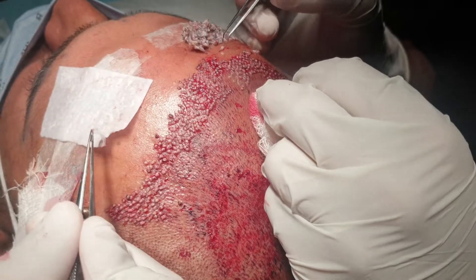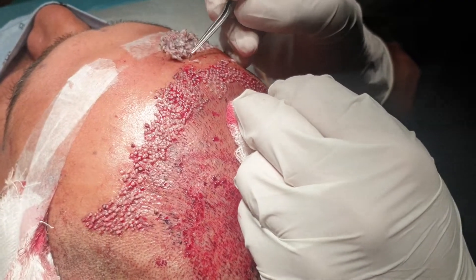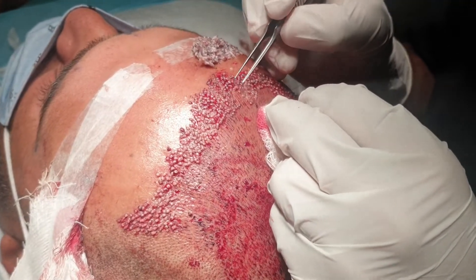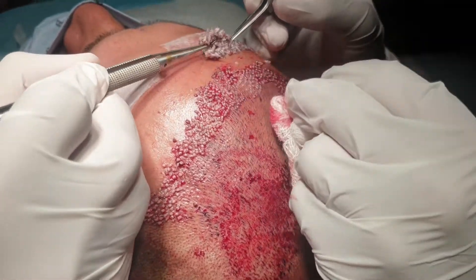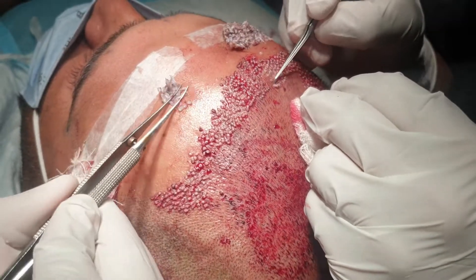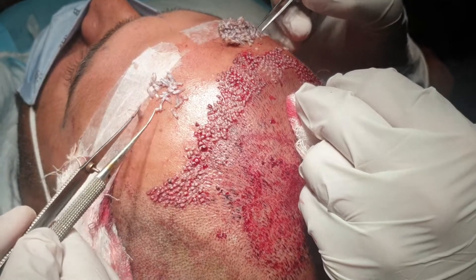If you skip a hole now, you will have to search for it later on, which is not time-efficient. So we always try to arrange the grafts and put them in the patterns that were made at the start.